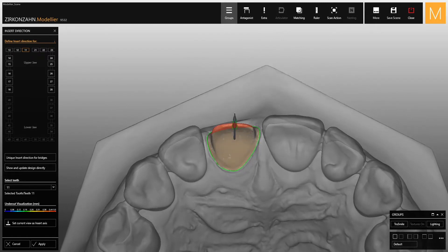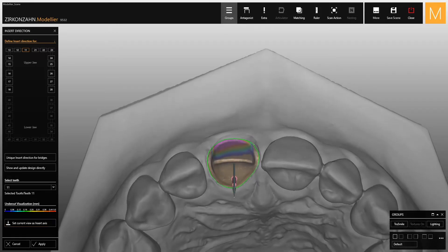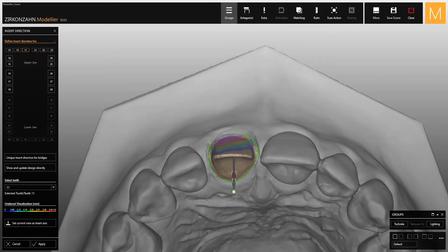To set the insert direction, you can decide whether to use the traditional method by selecting the respective option at the bottom of the menu, or to modify the arrow orientation directly.